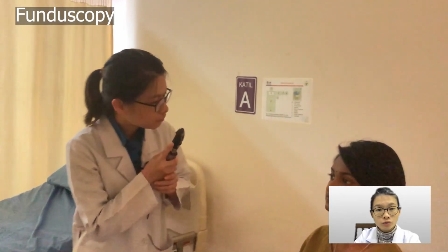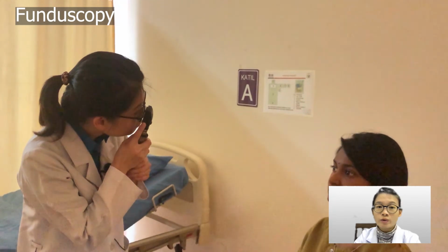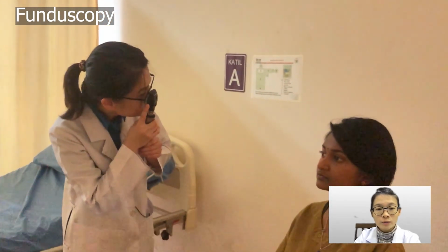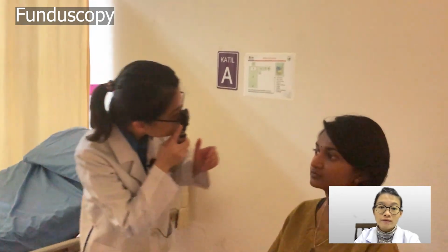We will perform fundoscopy at the end of the examinations. It is essential to darken the room for the fundoscopy. Always explain to the patients the process of examinations. When examining the patient's right eye, hold the ophthalmoscope with your right hand and look with your right eye. When examining the patient's left eye, hold the ophthalmoscope with your left hand and look with your left eye.